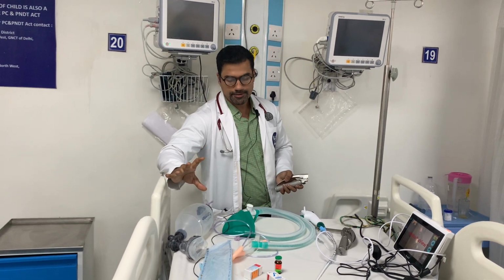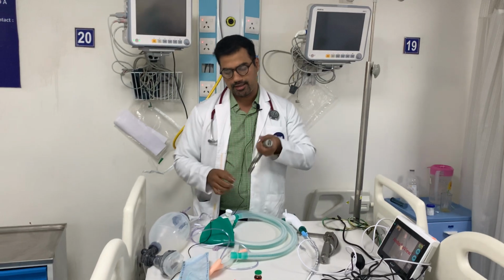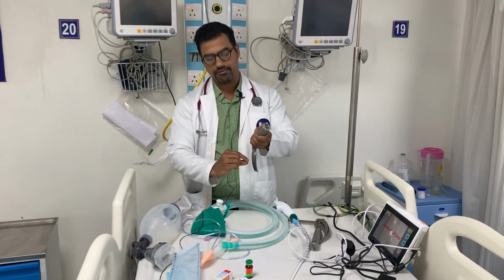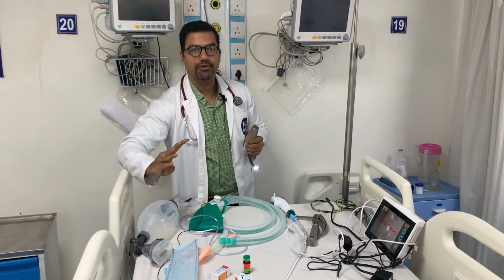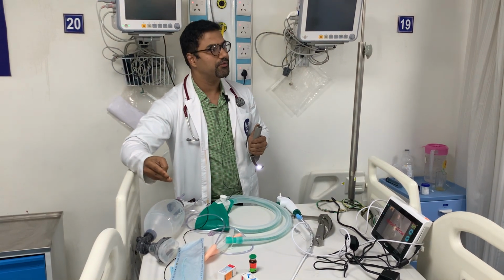When you intubate, you have to take care that you have checked your scopes nicely, and then you go inside, and after visualizing the vocal cords from the right side of the scope, you will just push the endotracheal tube. Fine. We have covered the drugs, we have covered the instruments, whatever we have.